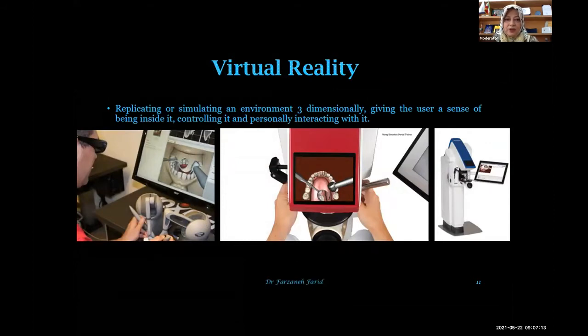In this kind of program, or this kind of training, you use virtual dentics or dental forms. It is not real, but you can interact with it. It means that when you are preparing, you prepare a tooth without any tooth being there. It is not real, it is virtual. And also you can feel passing through enamel, reaching dentin, or entering the pulp chamber. It is called haptic sense. It is a touch sense, a very sensitive touch sense.